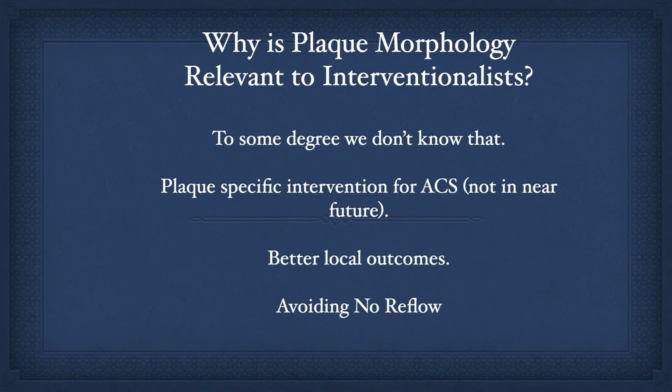Why is it relevant to physicians, cardiologists, and interventionalists in particular? To some degree, we don't know, because we don't have great data, in my opinion, correlating OCT images with histopathology. At least it hasn't been done in a way to convey it to the interventionalist.